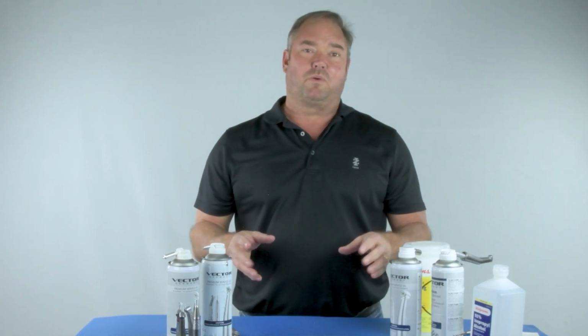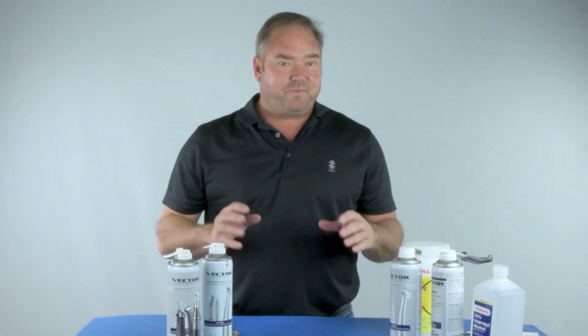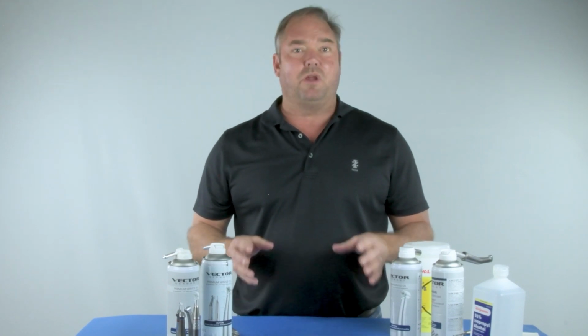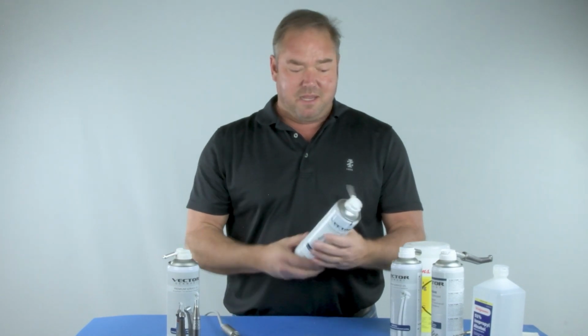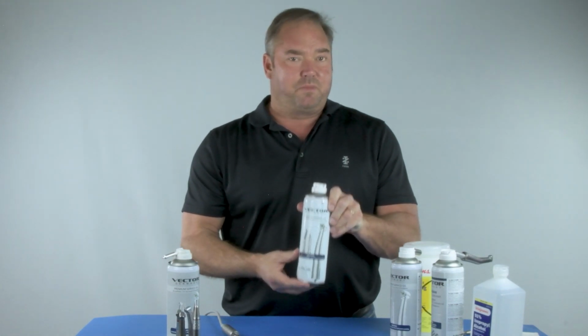However, before we get started, I wanted to address a few things that were mentioned in the videos but need to be clarified. First, we do not recommend lubrication machines because they can run dry and it's very common. You won't know until it's too late, until thousands of dollars of damages are done. We recommend the manual lubrication of the handpieces, and we recommend Vector Spray. The Vector Spray is in the P4D formulary.